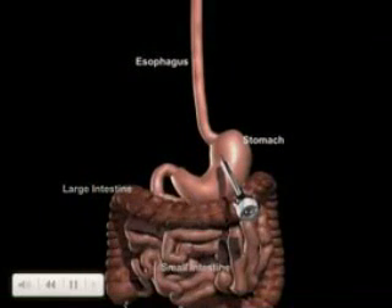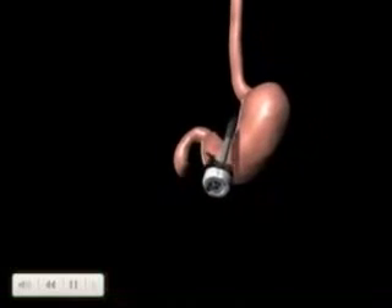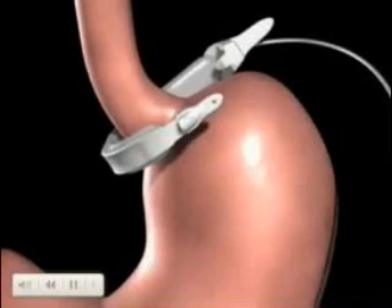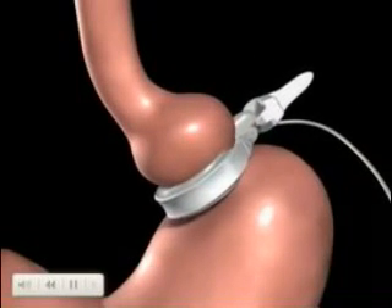The surgeon examines the abdominal cavity using a laparoscope or video camera. In preparation for the band, a tunnel is created behind the stomach. The realized band is introduced to the abdomen through a trocar, then positioned around the upper portion of the stomach and secured using the locking mechanism.